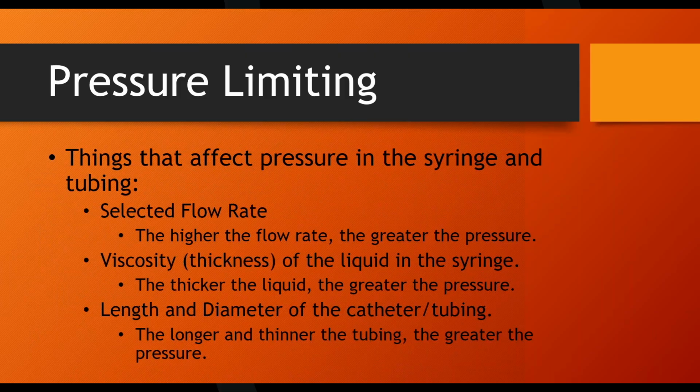So it takes a lot of force to get that fluid through there. So the thickness and the length of the tubing can also have a small effect on the pressure that gets built up in the system during the injection. And I forgot, and the thickness of the liquid. Now, one of the things that, I don't think I have one anymore.